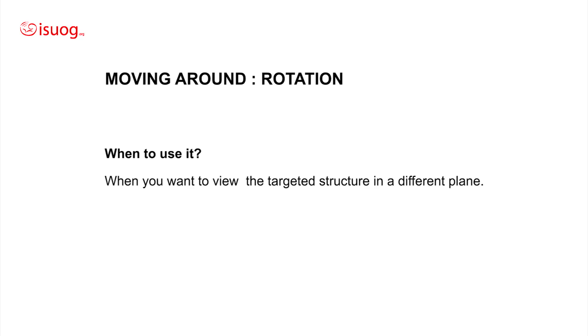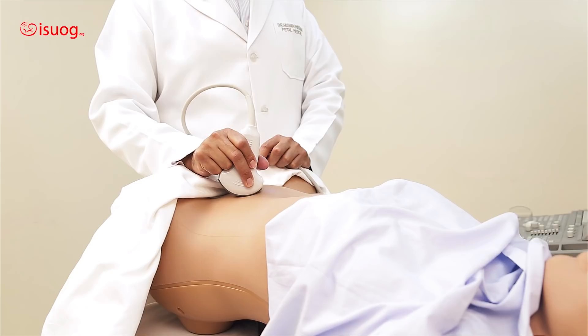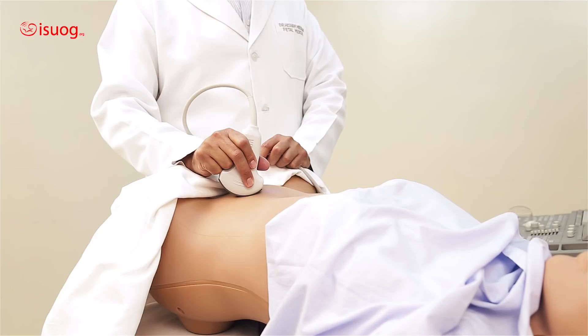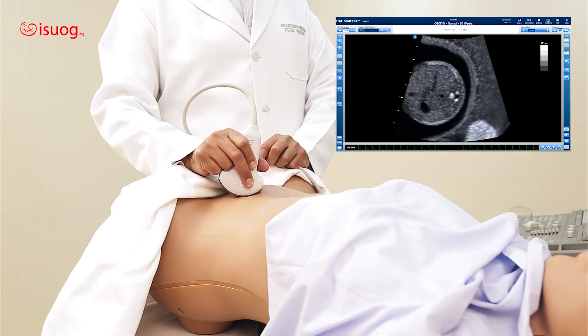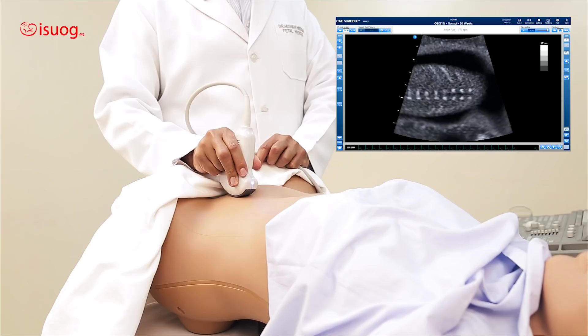We use rotation when we want to view the target structure in a different plane. If you look at the screen, you can see the plane of the abdominal circumference, and you can see the vertebrae in an axial view. Now, if I want to see it in a coronal view, all I need to do is rotate. And as you can see, we are now looking at the vertebrae in a coronal view.